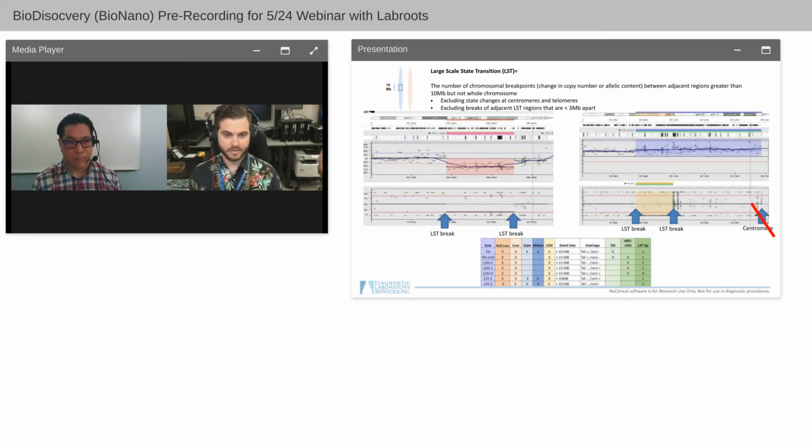And this is something that NX Clinical has worked very hard to evaluate and allow automatic scoring towards. And it's a really bright new future to be able to evaluate these much more quickly than formerly in a manual sense. So I must commend them for working very hard to do that.